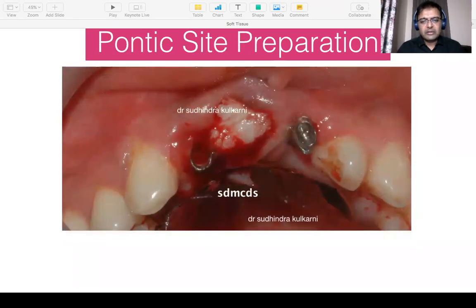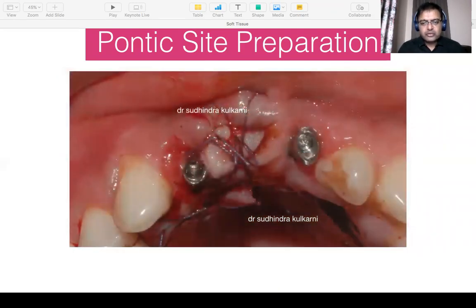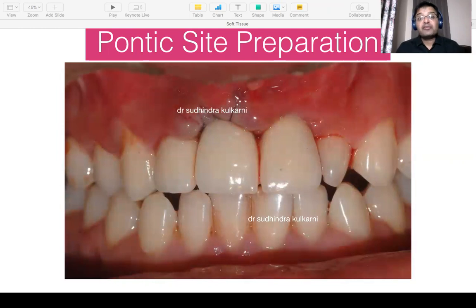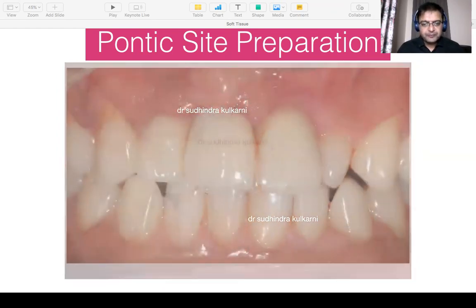So you go to the palate, you take a free gingival graft, what we call a conventional free gingival graft. You leave the epithelialized portion at the top, and then the perimeter is de-epithelialized, and then you suture it. And as you suture it around, hold it, and then you do a final cementation of your bridge. It's on the day of your final cementation. So till then, there's no grafting done. So you do the final cementation of the bridge. The graft that you placed would heal underneath this pontic.